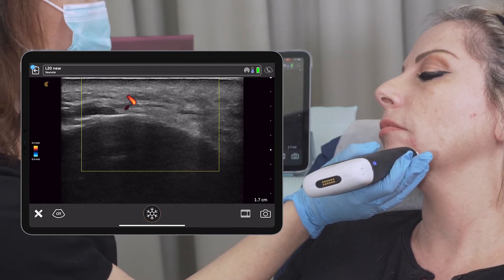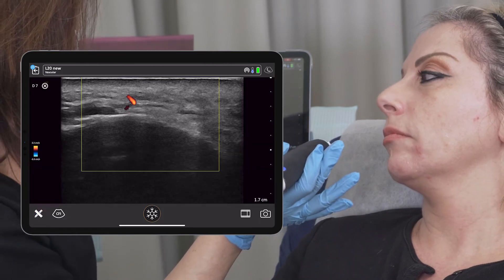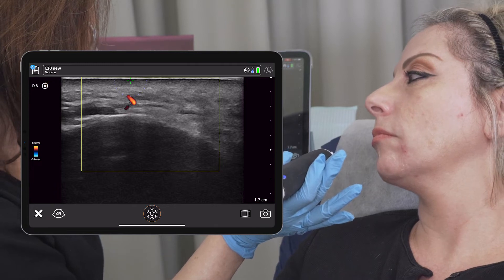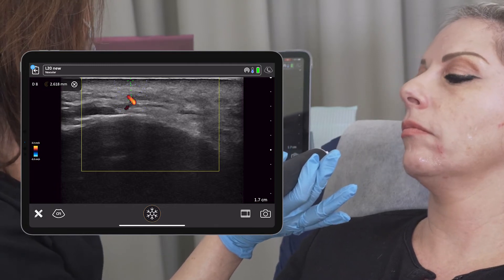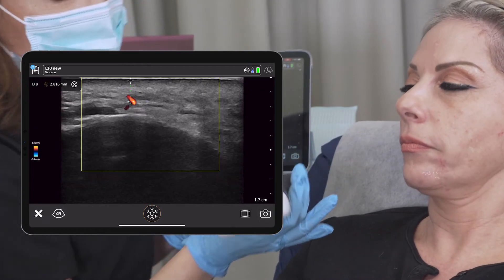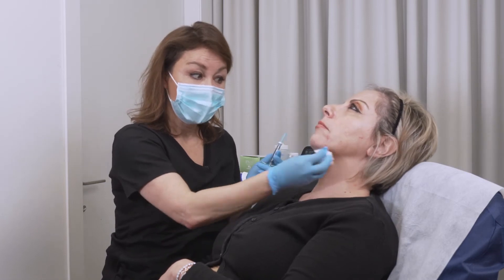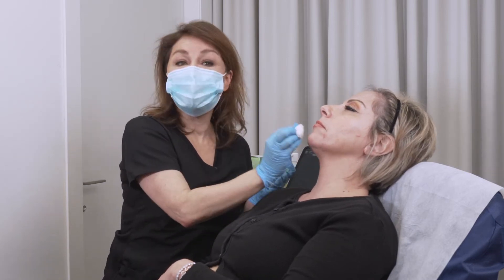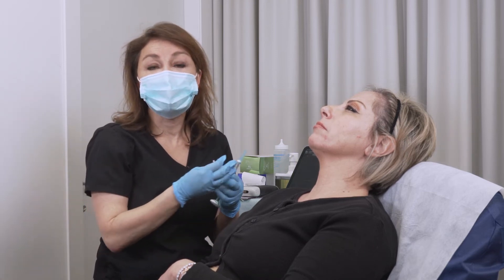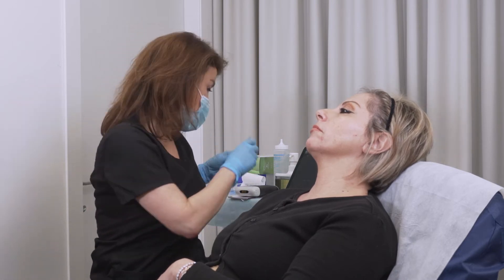Here in the middle we can see another vessel, and I'm going to map the level of this vessel — it's in the muscle and it's 2.6 millimeters in depth. We've now mapped the arteries, seen their level, and confirmed that if we inject deep on the bone we are actually safe.